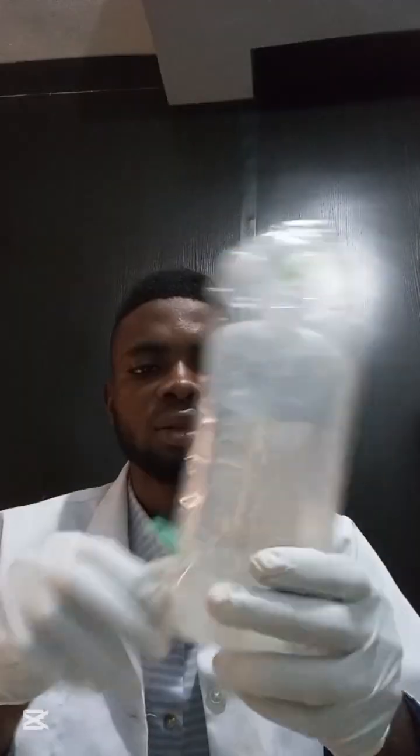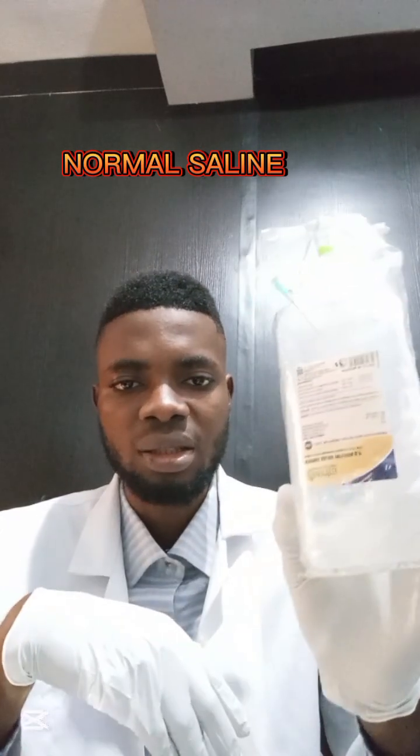Now another instrument that is sometimes used is the normal saline. This is the normal saline. Most times it's used to mix with the contrast agents. So if some persons are using a 20 ml syringe, what they will do is that they will take 10 ml of the contrast agent and 10 ml of the normal saline and mix it up before they introduce it. So those are some of the instruments used for HSG.